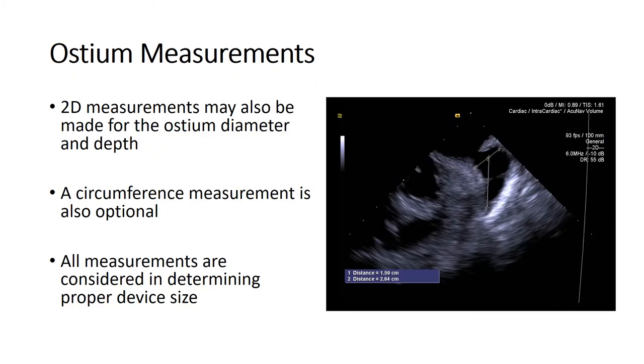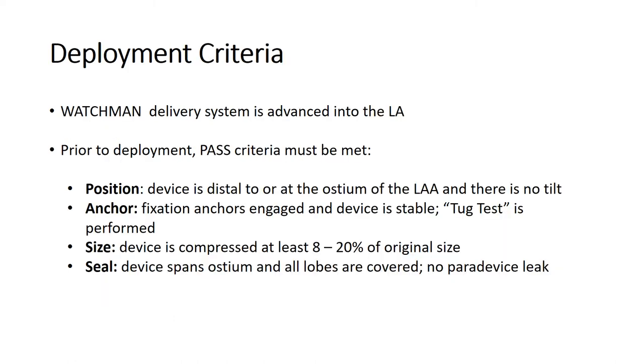It is also important to note that 2D measurements for the ostium diameter can be performed with 2D imaging. Ultimately, it is the operator who must consider all measurements when determining proper device size. Once all left atrial appendage measurements are completed and adequate device size is selected, the operator proceeds to deploy the left atrial appendage closure Watchman device using the conventional technique.